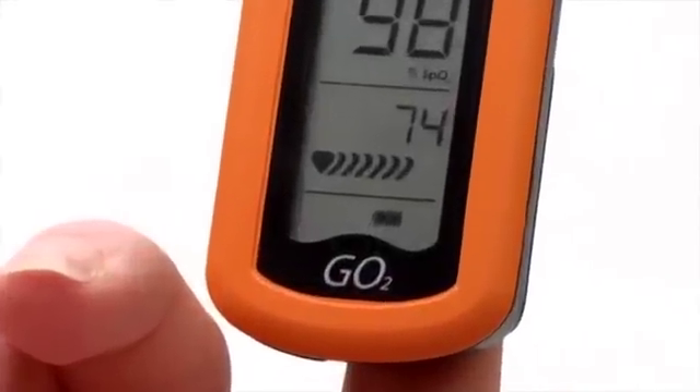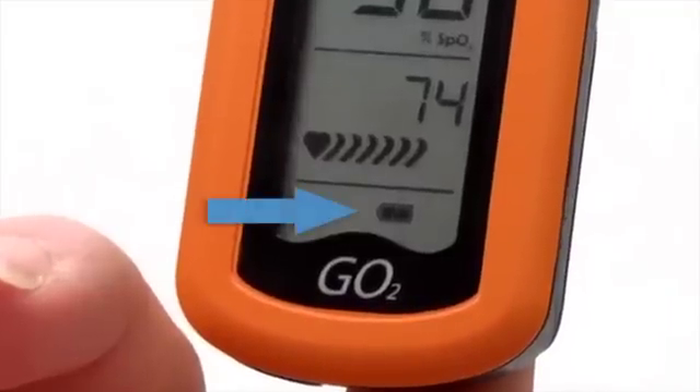You can see the remaining battery life and when a battery change is needed during use. The indicator will flash when the battery reaches a critical level.